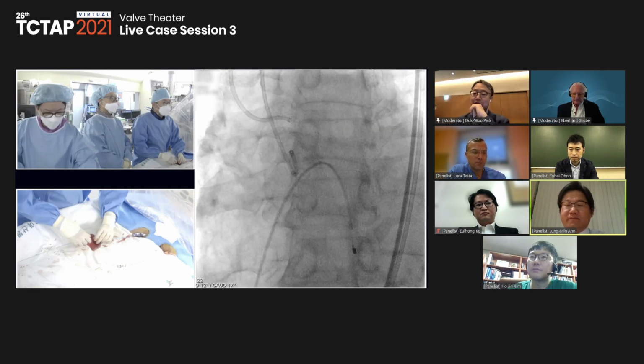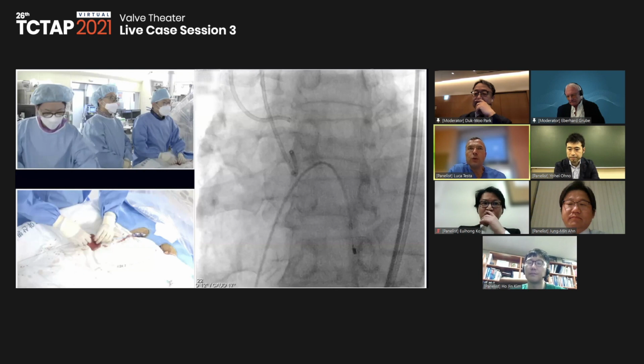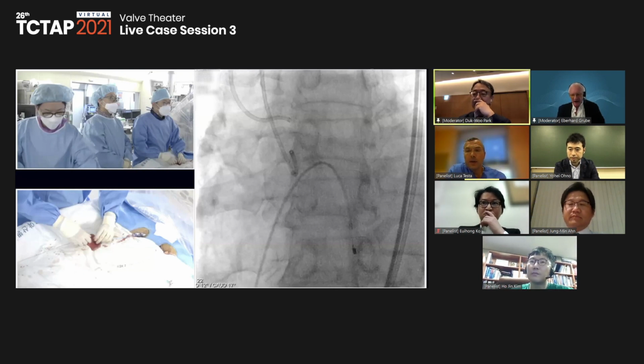Yeah, nice comment. How do you usually do it, Luca and Yohei? What we usually do is we rely on 3D echo. I must say, this is because we started our TAVR program 15 years ago with the same guy doing the echo. So as Eberhard pointed out before, it's a matter of experience.